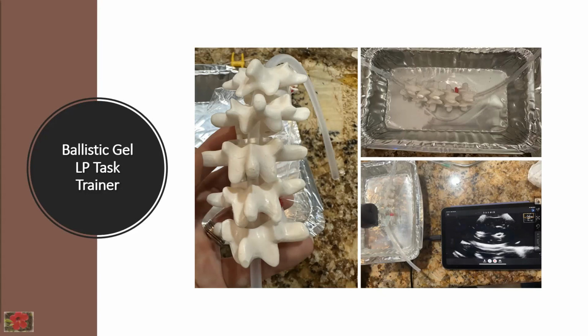So yes, you do have to pour it into another mold, a mold that is not prone to melting really easily. That's one of the first things to consider when you're choosing what mold to put it in. I use a lot of 3D printed molds, which are pretty resistant to heat. So I have an infant torso mold, so that if we flip it over, it looks like the front of an infant torso, like for our UVC trainers and things like that. But it is pretty hot when you first pour it in, which is when I have encountered the most heat, tiny burns, but it's not too bad.